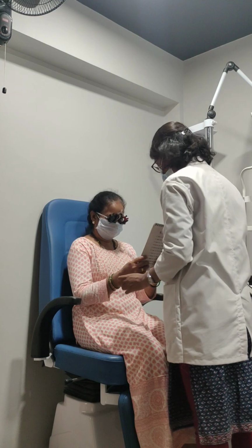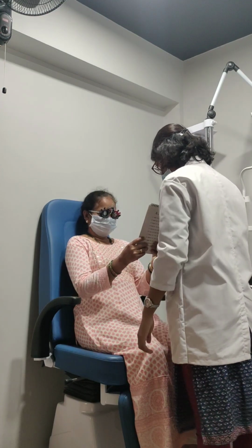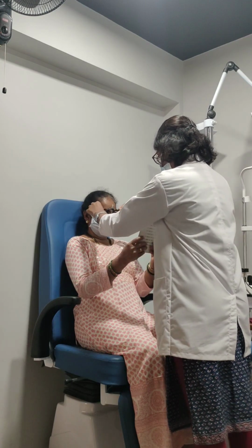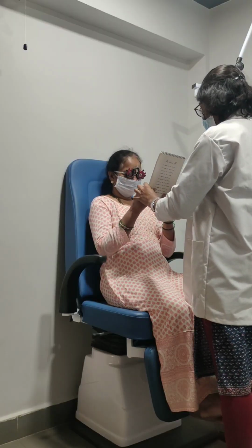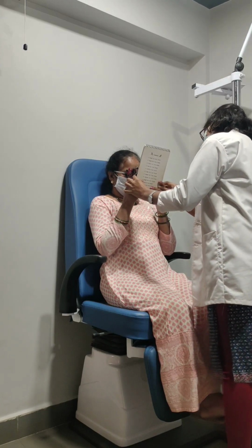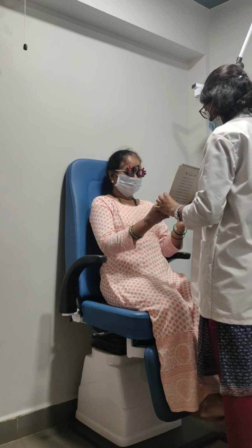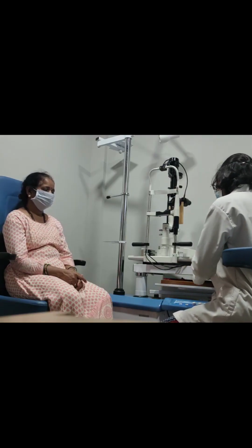After distance refraction, we have to do the near refraction, monocularly as well as binocularly. We also have to note at what distance the patient is seeing the near vision chart very clearly. Now you will get the final prescription power.